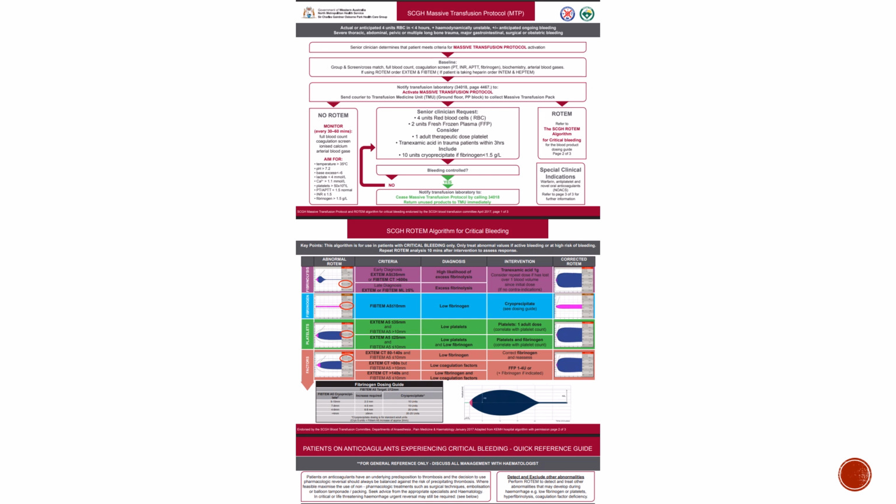You get these hideous looking guidelines with lots of diagrams, lots of detail and information, and you see the ROTEM and your heart sinks slightly because you've never really committed to memory or fully understood what it's talking about. Hopefully we will address that.